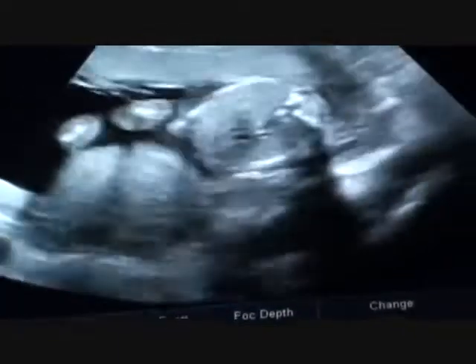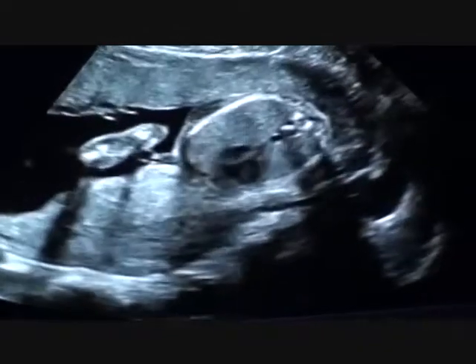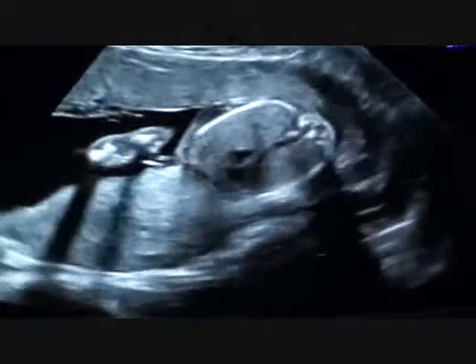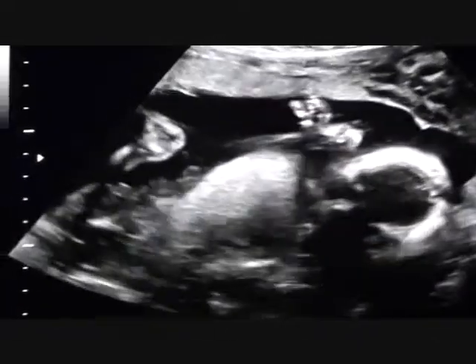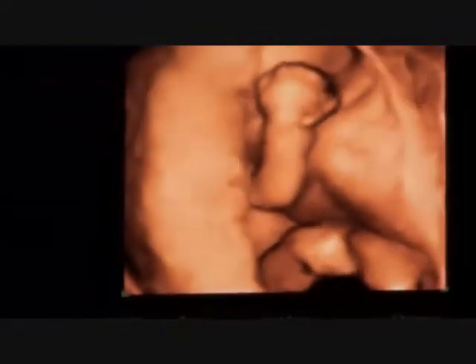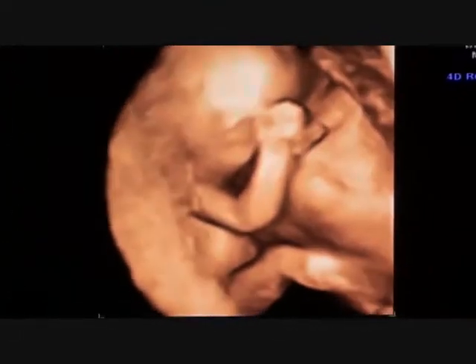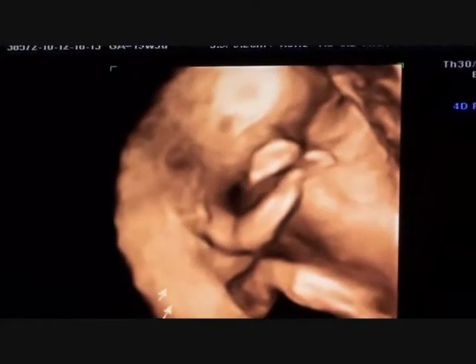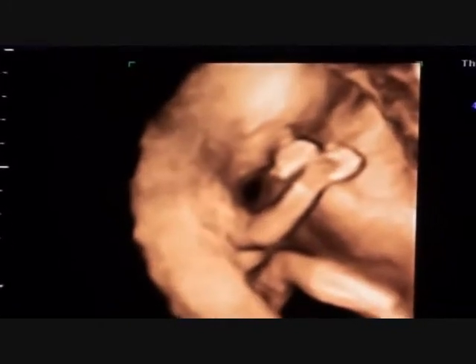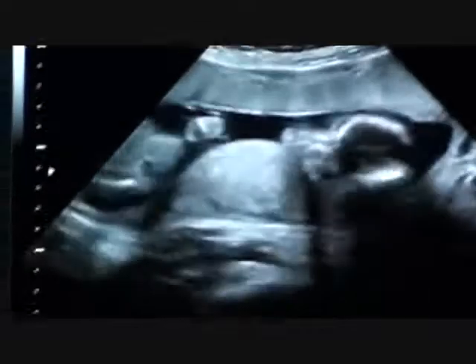We still need a heart — let's see if we can get a better heart. Kind of where his belly wasn't going to go, he went right back in. We'll get to see his heart a little bit better later. Still looks like all four little chambers coming in, but you can see how it's just a little bit fuzzy. See the little hand, see the little fist. It's his favorite spot to snuggle up to — that's what he did last time. He's got a pillow behind him and a snuggly thing in front of him. Both hands up there. You can make out fingers every once in a while when they kind of open them up.